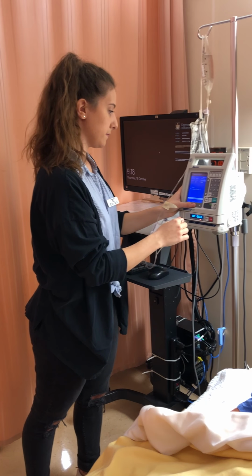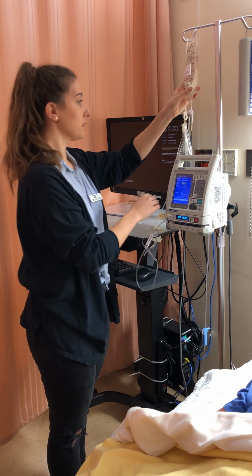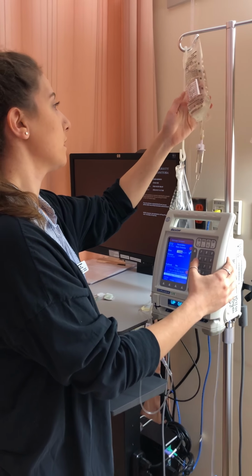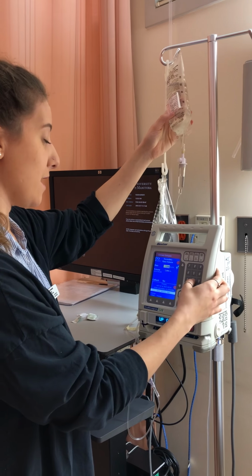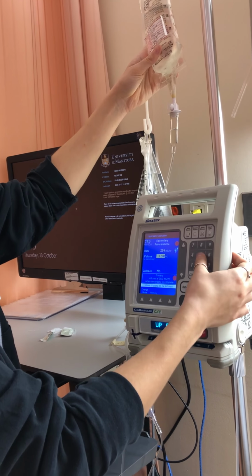Oh no, I don't know if I can. I put my label on there. I'm going to put my numbers in. So my rate will be 254 milliliters an hour. My volume is a 254 milliliter bag.